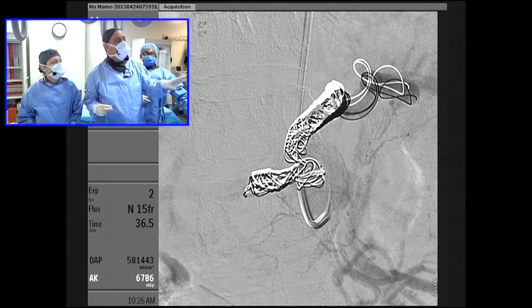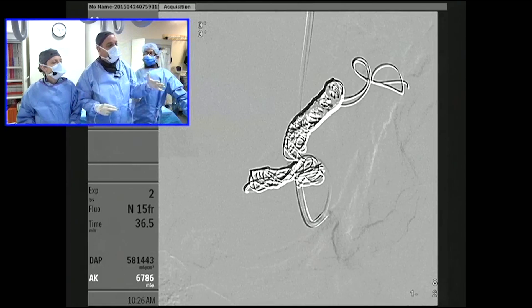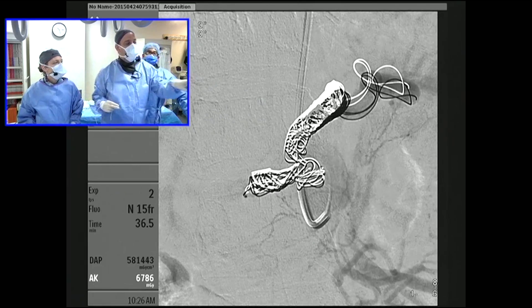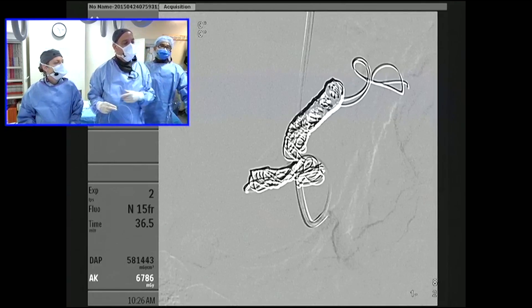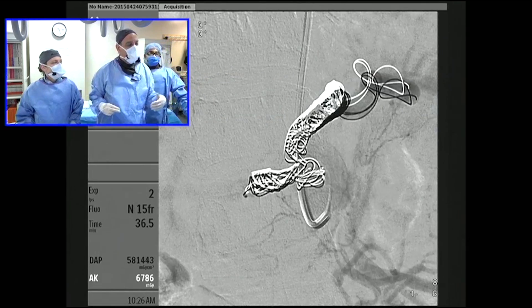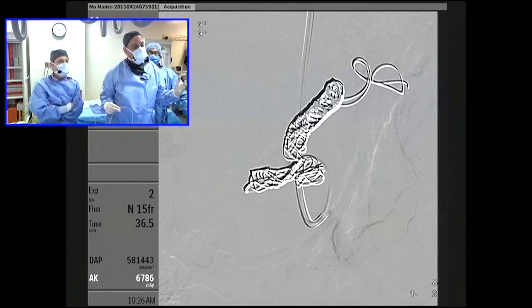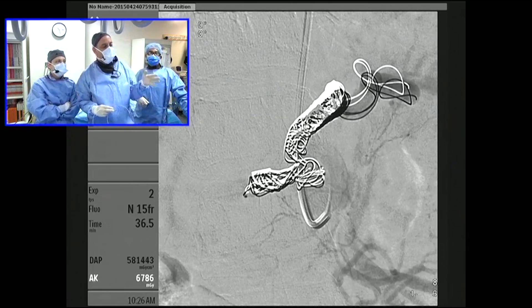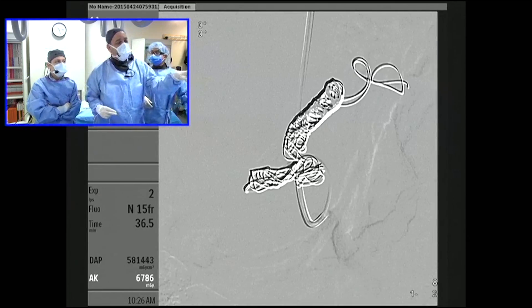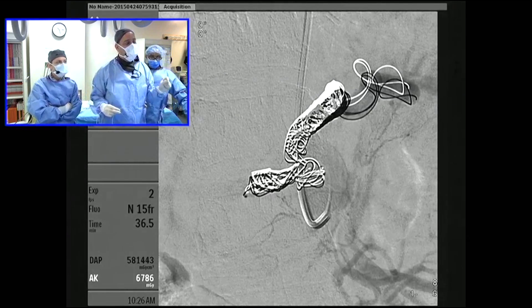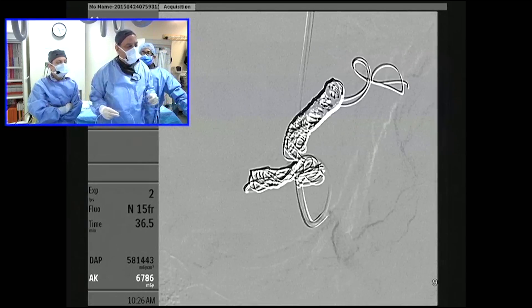Here we had backed ourselves out of the splenic artery, and by luck, the microcatheter flipped over into the hepatic. We're very proximal to the hepatic, and we really wanted to preserve the gastroduodenal artery. We were happy with the positioning of the coils here, but as we tried to lay down more coils in the stump of the common hepatic, we were getting pushed out.